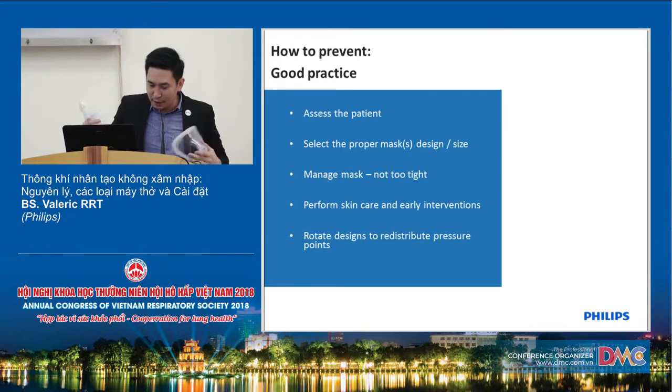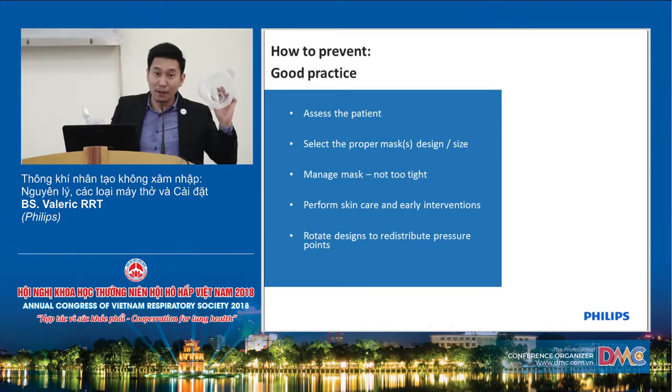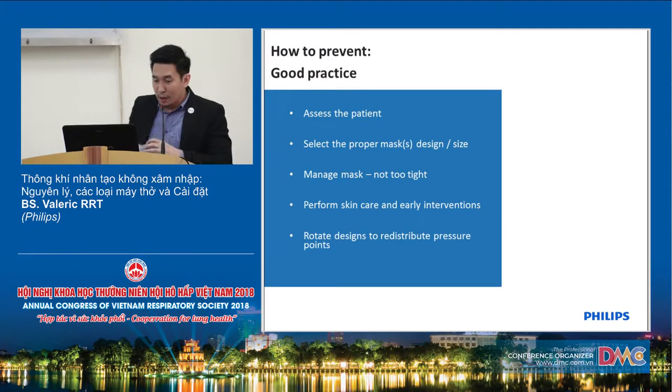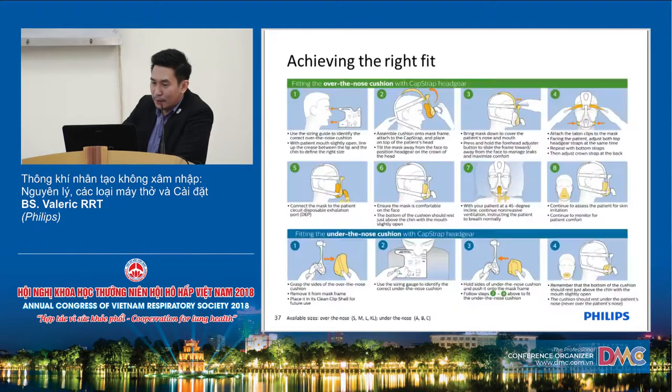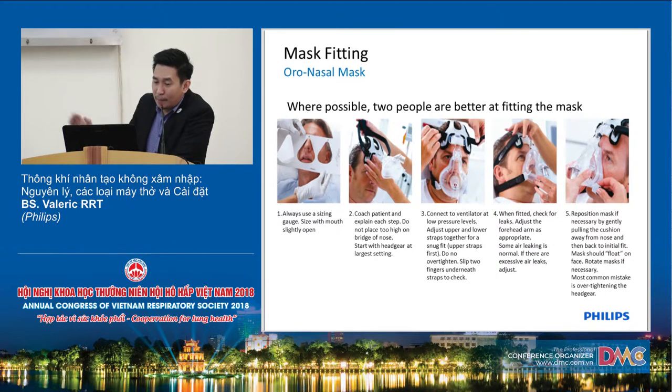But if you have the new model of the mask, the AF541, there is no need to use the full face mask. You can bypass the bony part of the nose. So choose the right mask for your patient. We have different sizing tools for you to know what type of interface to use for each individual patient. And this one is an example as well.